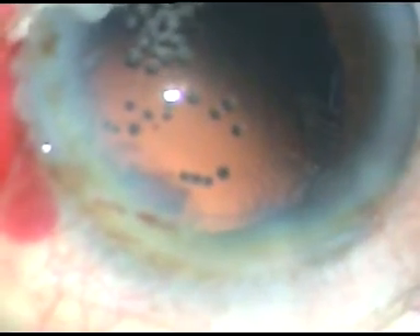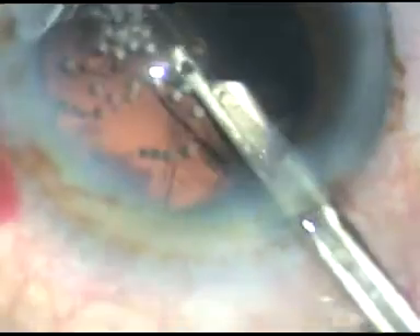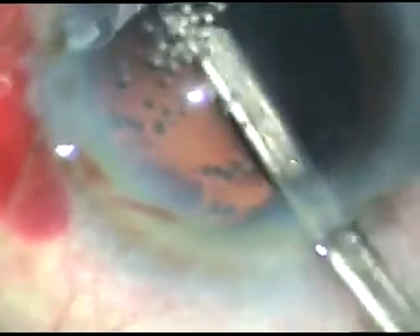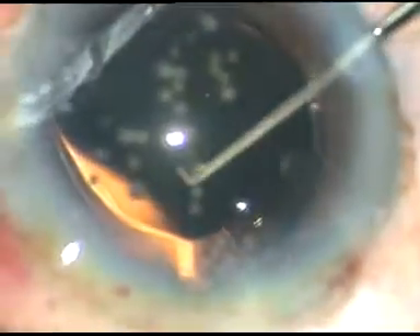Now some viscoelastic substance is injected. There is a little bit of cortical matter — you can see there is no epinucleus, because the epinucleus has been incorporated into the nucleus in this case. I have used a 23-gauge Simcoe cannula to remove the cortical matter. Now I inject viscoelastic substance and implant this intraocular lens — a hydrophilic acrylic IOL — which is being placed in the capsular bag.